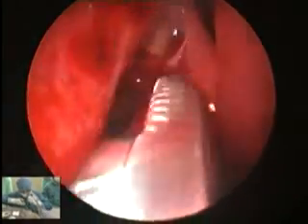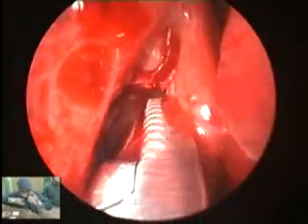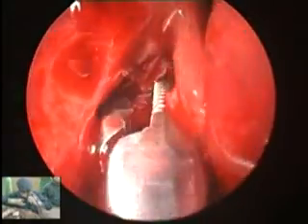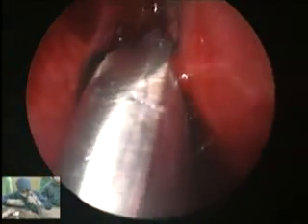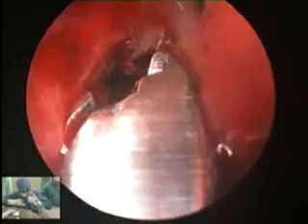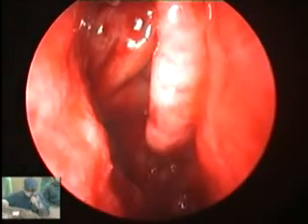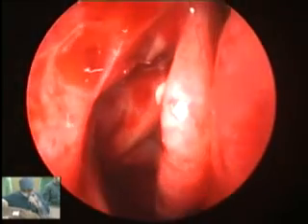Are you going to go into the frontal recess at all, or are you just going to... Probably it's free of disease from what I think. At the moment, I think the disease is basically limited to the maxillary sinus. All those we see in the anterior ethmoid is probably secondary changes.